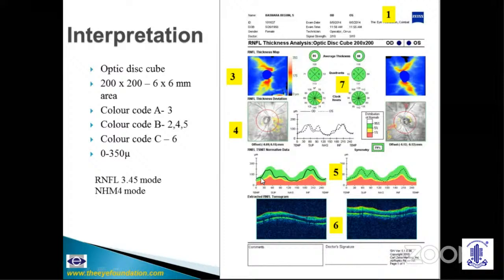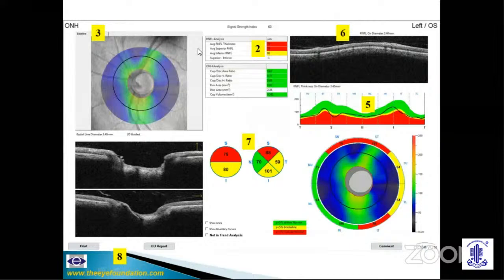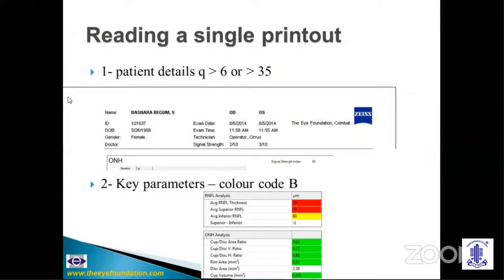The circular tomogram shows the raw OCT image on which segmentation is placed — two boundaries are automatically placed on the RNFL. Check for any artifacts or segmentation errors. Something like a vitreous ring or asteroid hyalosis could cause shadowing on the RNFL tomogram, making data unreliable. On the Avanti OCT RNFL deviation map, the superior RNFL appears okay here, but there is loss of the inferior RNFL — shown in blue, meaning thinner. This is well within the calculation circle, and the TSNIT graph correlates with the damage, clearly going into the red zone starting at the inferior region, suggesting inferior nerve fiber layer loss.